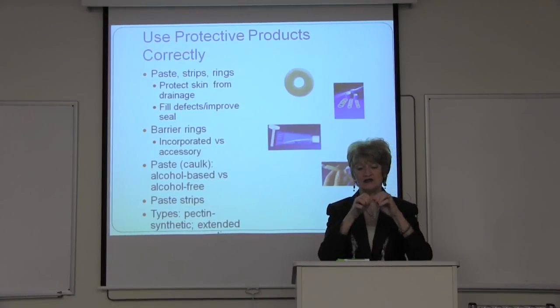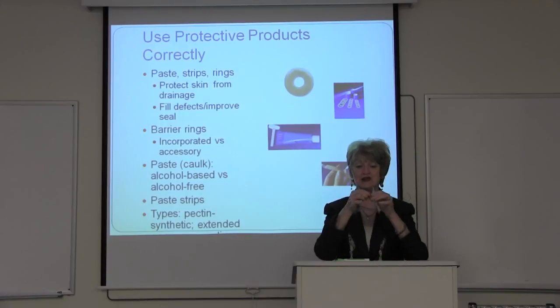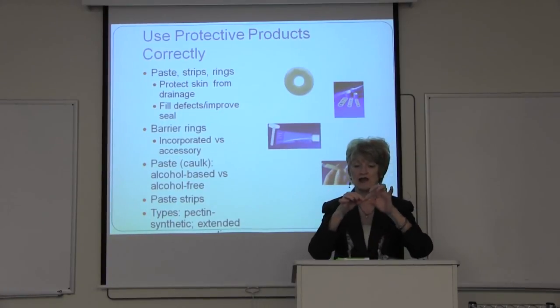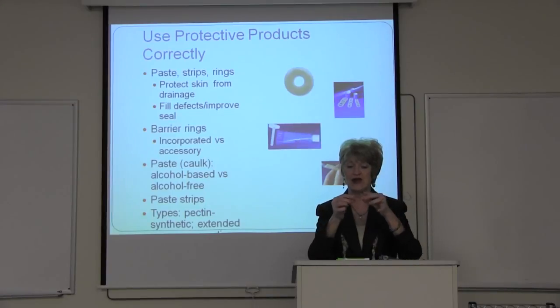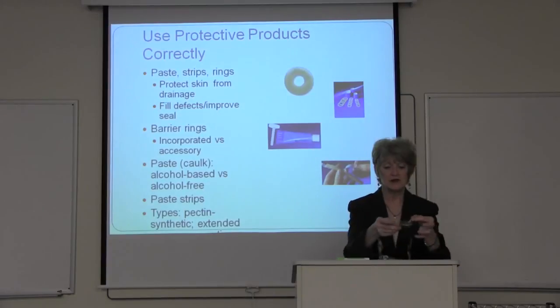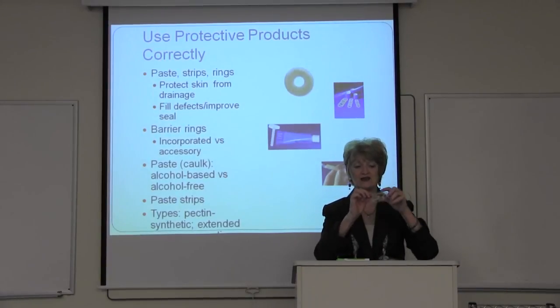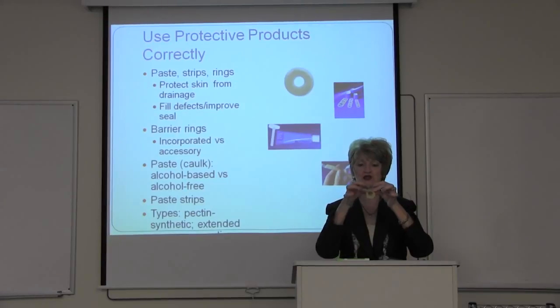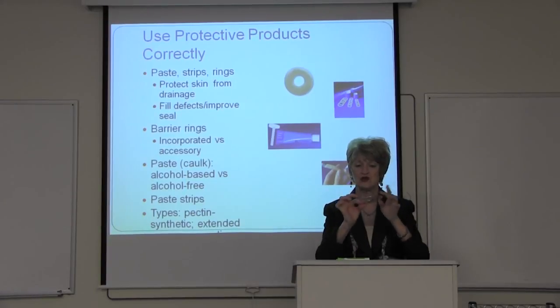And what I can do with these paste strips is I can pinch off however much I need. If I need it to fill a little gully, I can do that. If I need to create a little ring around my stoma, because the patient has raw skin, I can create a little ring around my stoma, so I can do what I need to do with these paste strips.